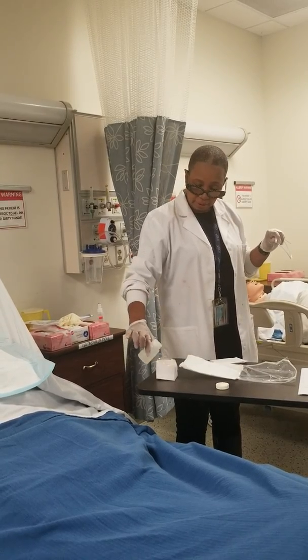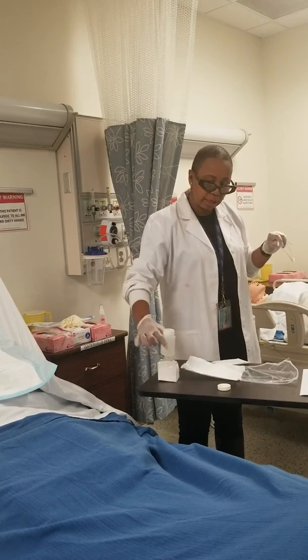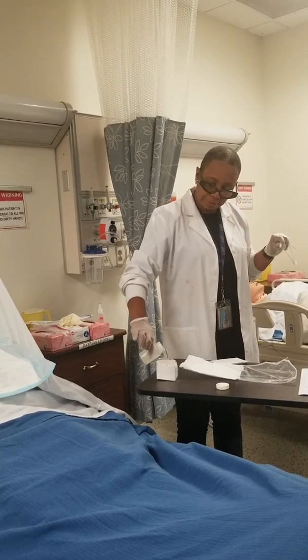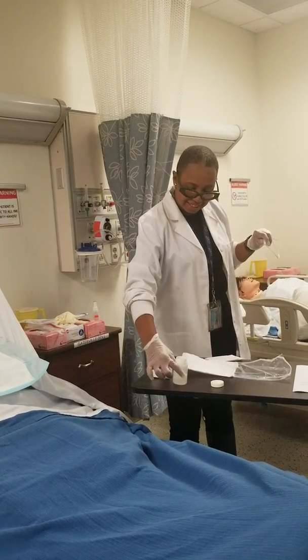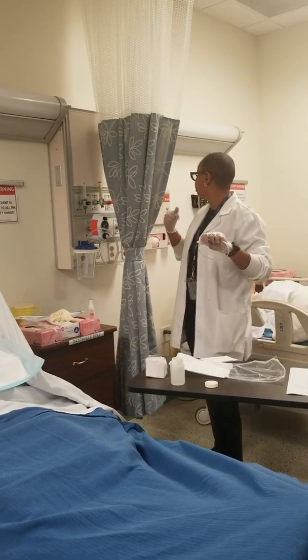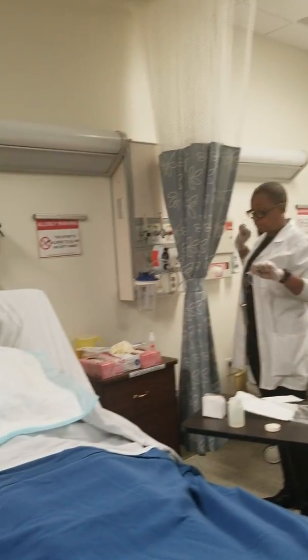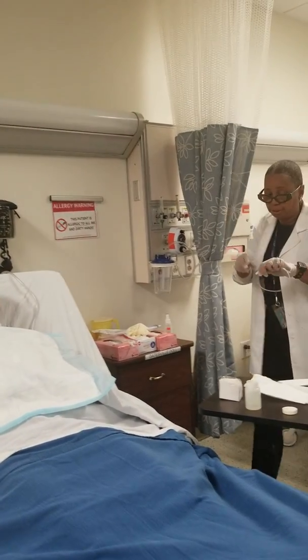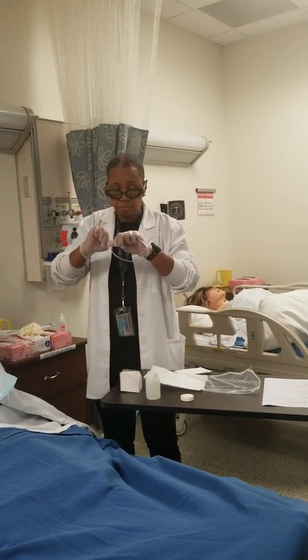Should I pour it? Yes, pour it. I think that's why in the video she only put one glove on first. I'm talking about the sterile liquid. Remember, she only had one glove on. She poured it with a bare hand, and then put the other glove on. Okay, so what else?